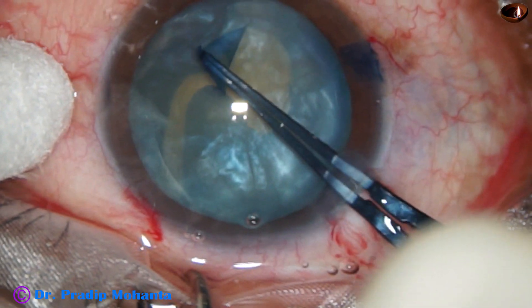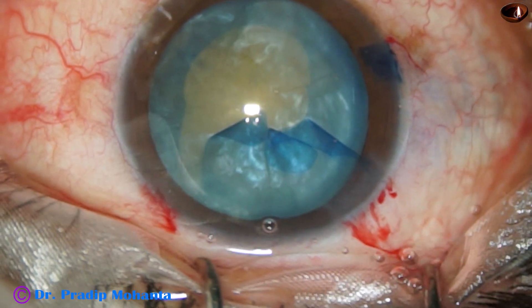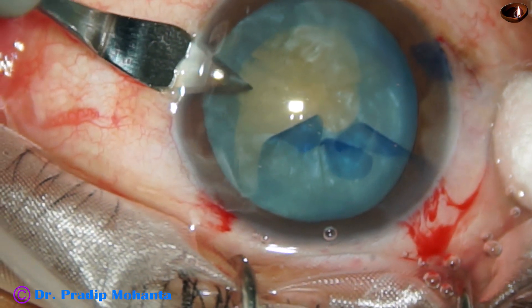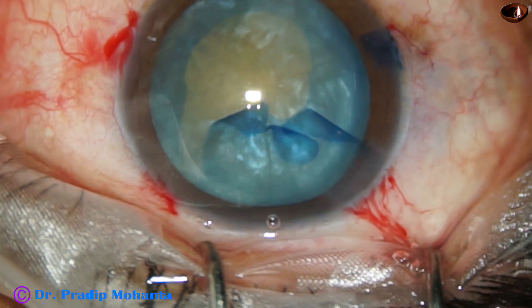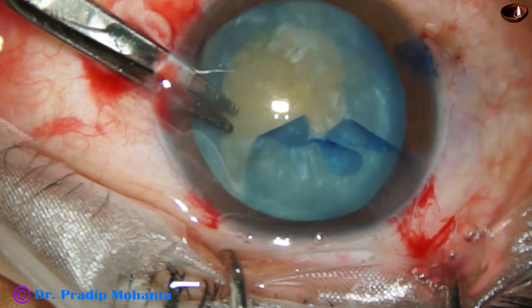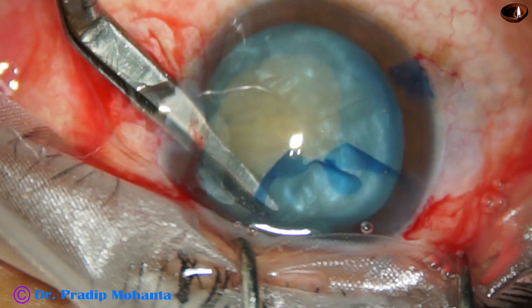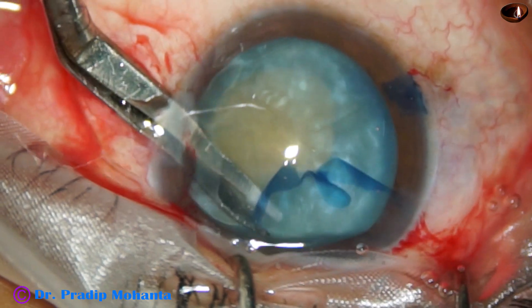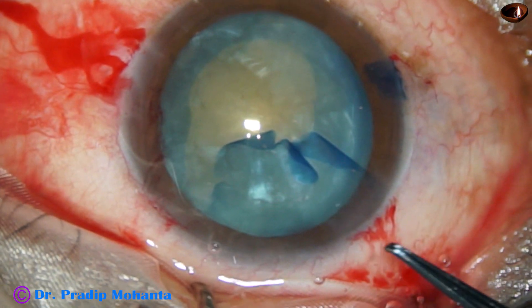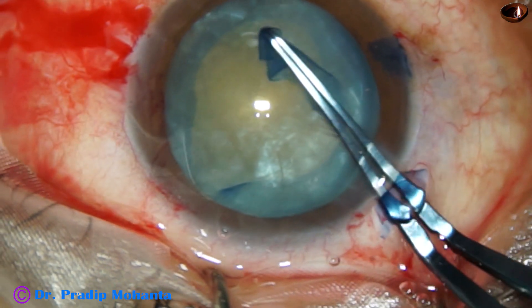I make a NIC at 8 o'clock and a relaxing incision is done inferiorly. I take the keratome and make a posterior limbal incision at 4 o'clock. Then I take the Vannas scissors and make a cut on the capsular flap at 2 o'clock — it should be a nice cut. I then take the Utrata forceps again, hold the capsular tag, and enlarge the rhexis on that side.